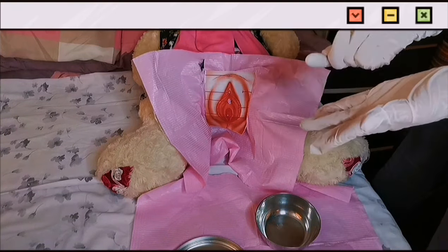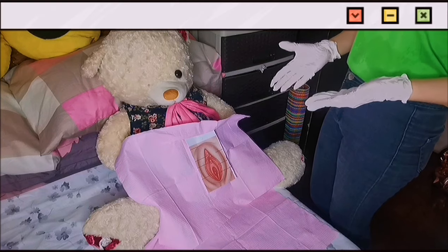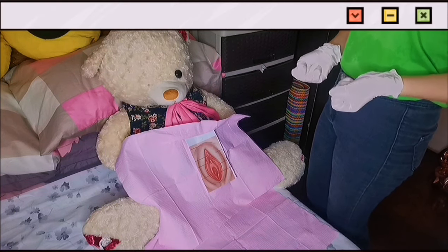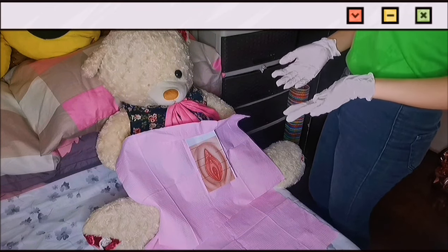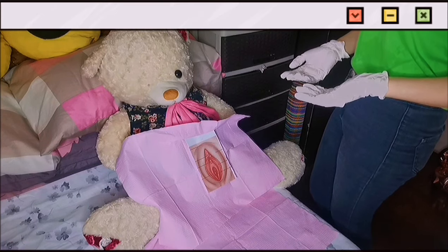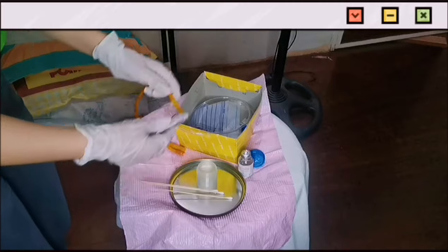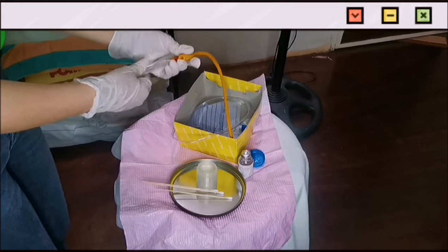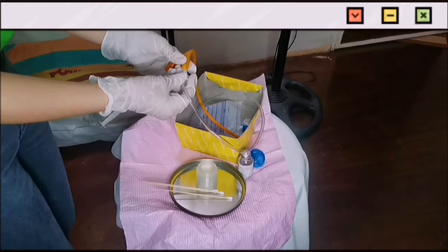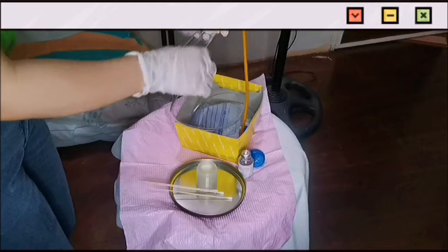Then we will wash our hands again to put on sterile gloves. Next, ask the patient if she is allergic to latex and betadine. So, Ma'am Max, are you allergic to betadine? How about latex? Assuming that we have betadine. These are the swab sticks, this is sterile water, and this is the drainage bag.